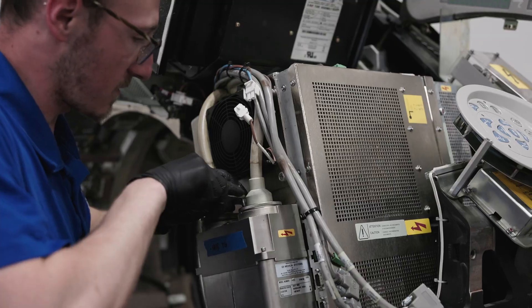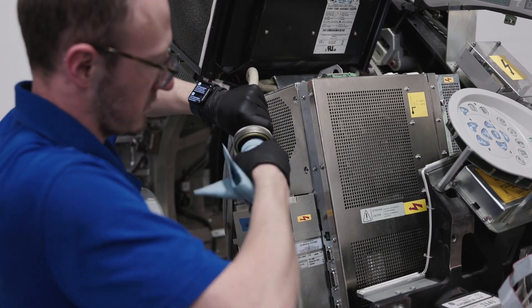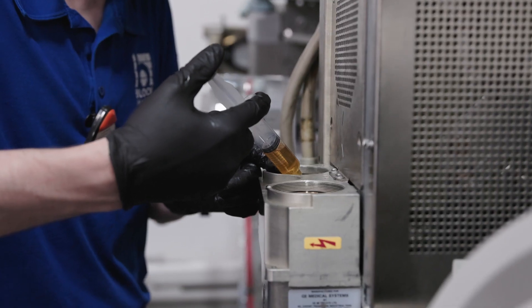These steps are identical, and what they consist of is taking the repaired or reloaded tube housing assembly and installing it on the exact make and model of the CT scanner for the intended application.